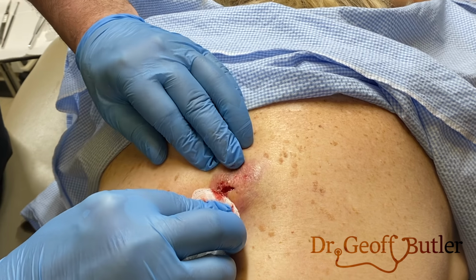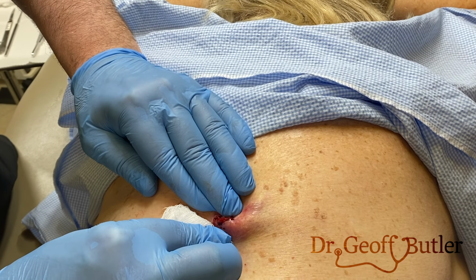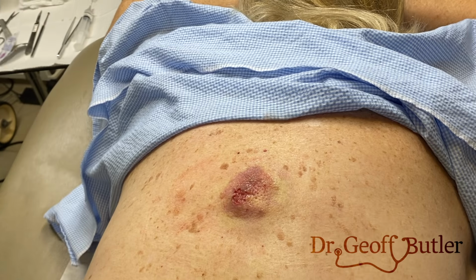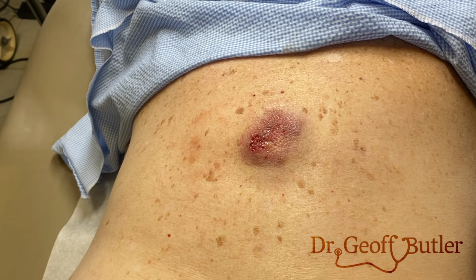So in these cases, I'm going to want to syringe this out, and then we'll pack it so that we get the chance that if there are loculations that we haven't broken down, that it can collapse into it overnight. See, it drains a little bit more since we've done that. Is there a swab line, Greta?